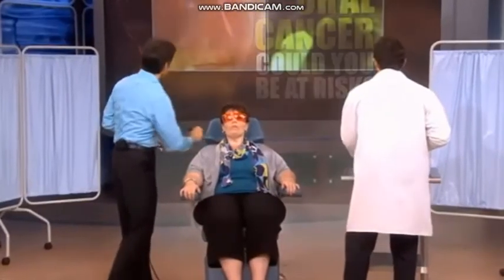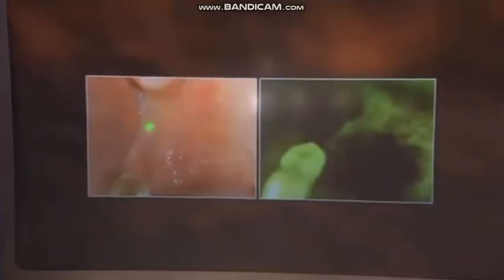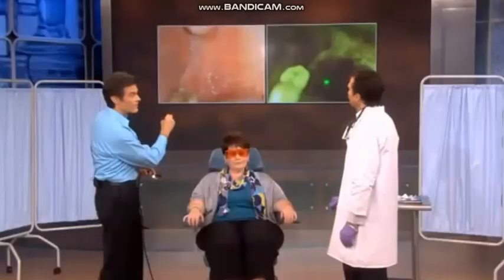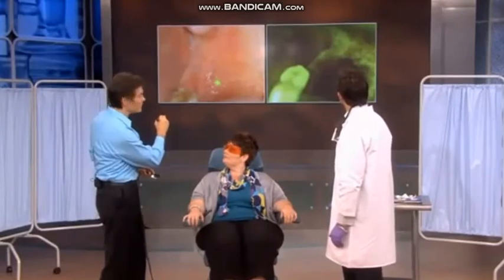Here's the picture that we would have gotten normally. This is a normal eye view. It's just, tooth is here, and you don't see anything too abnormal here. But notice this area looks a little bit indented. Look what happens in the VELscope. Instead of the normal green, you have that darkened area. So you all see that? Yeah. So it's very helpful to aid the eye in identifying that as not being normal.